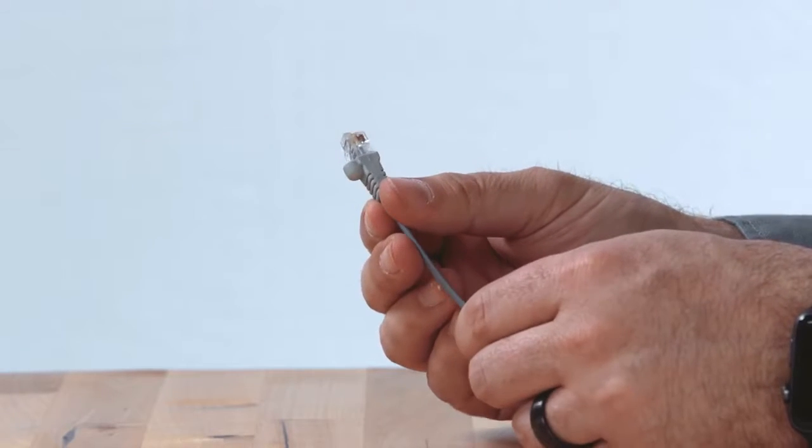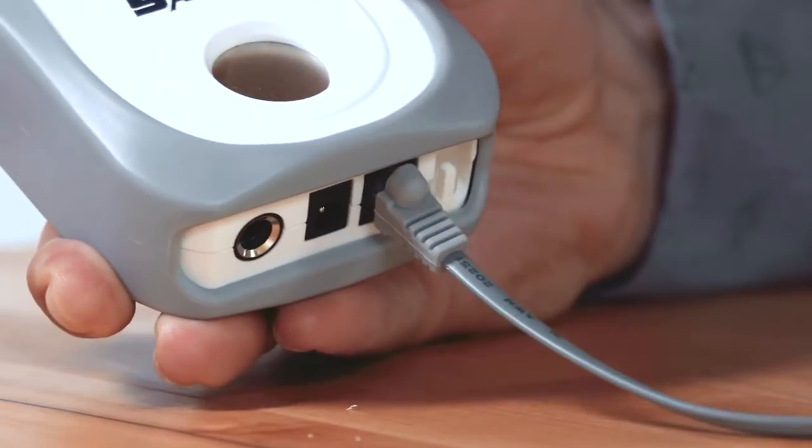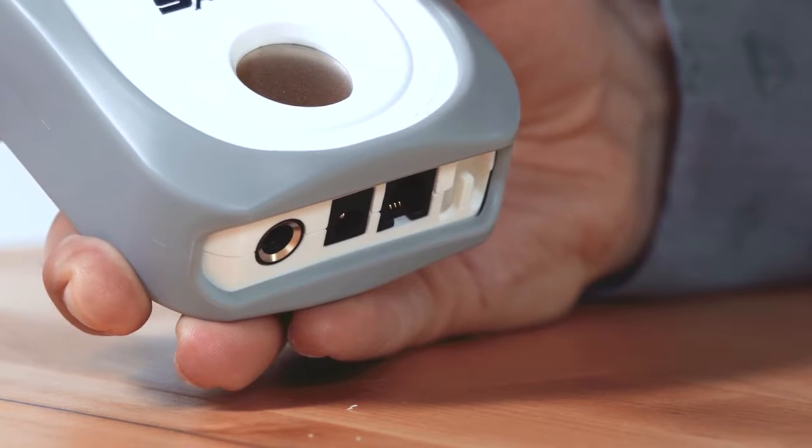Be sure to check the sensor pad cord and connector for signs of damage before use. When removing sensor pads, also be sure to press down on the connector clip that locks the connector in place prior to removal from the base unit.